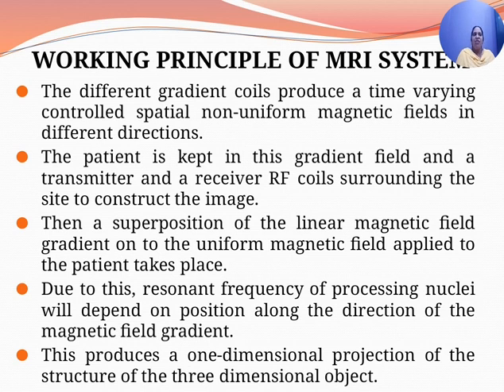However, during the imaging process, the field must be distorted with gradients. A gradient is just a change in the field strength from one point to another in the patient's body. The gradients are produced by a set of gradient coils which are contained in the assembly.